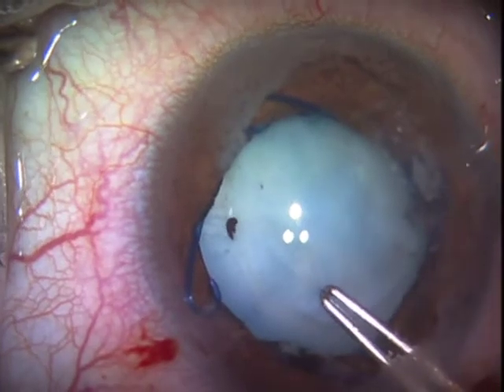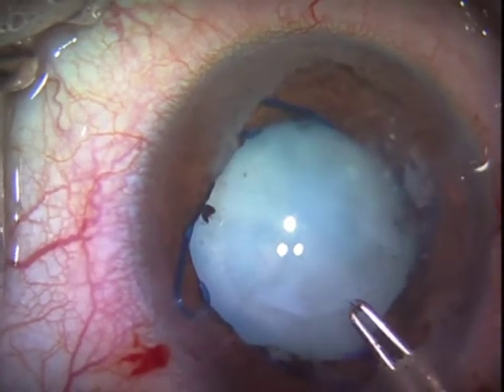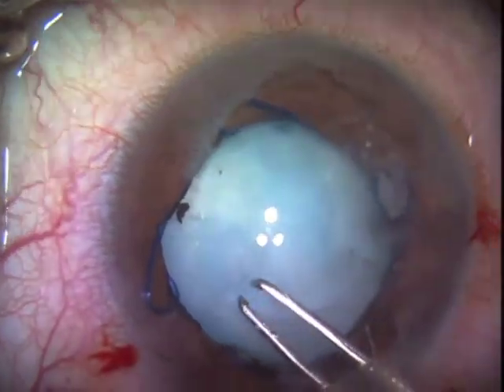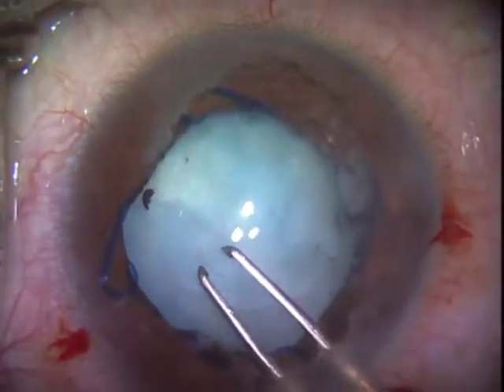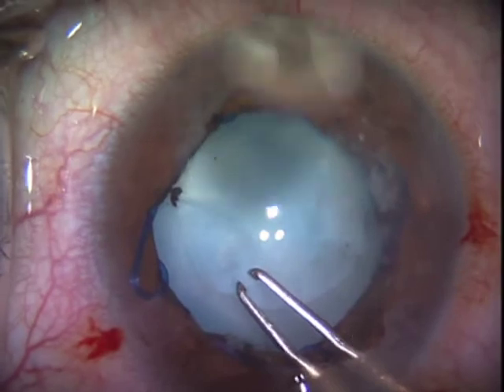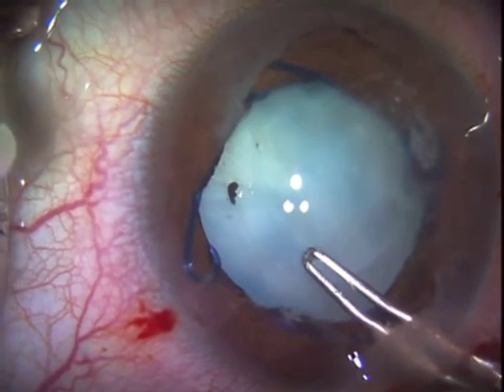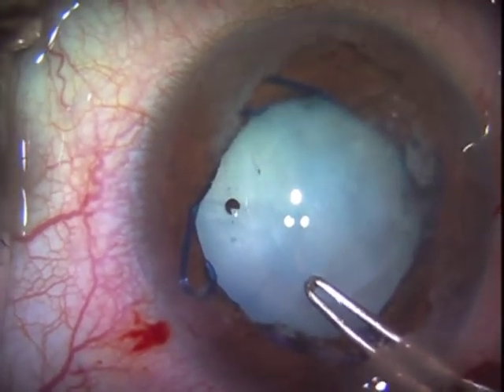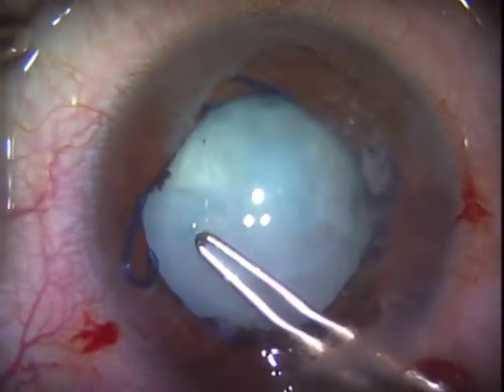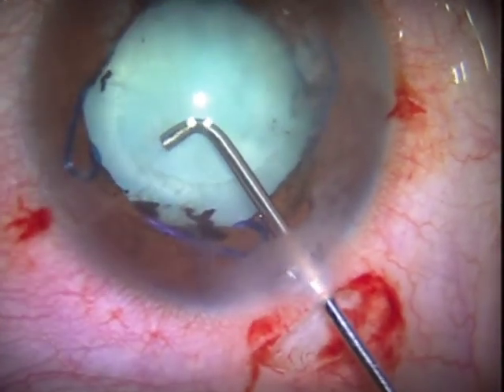A little later on we're going to use the capsule scissors or retinal scissors to cut. Many times these fibrotic anterior capsules have ridges of fibrosis that you can cut through and then carry on with tearing, but this one appears to require a lot of cutting. I have to be careful not to pull too hard and stress the zonules.